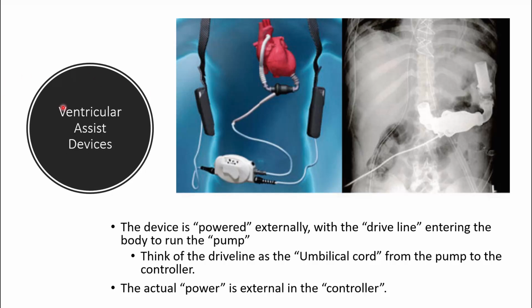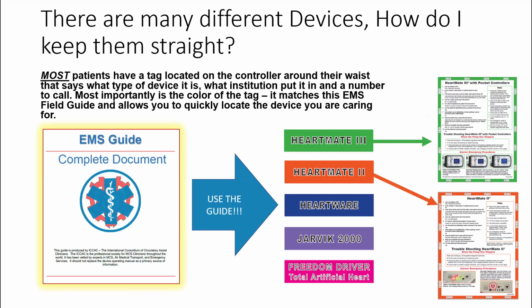This is important to know when you look at these devices, and you have to be really careful managing these. Now you think, okay, well, how will I keep this straight? If there's all these different LVADs out there, how will I keep this straight? Well, there is a device. We're just going to call it the EMS guide. It's from the International Consortium of Circulatory Assist Clinicians, so perfusionists.